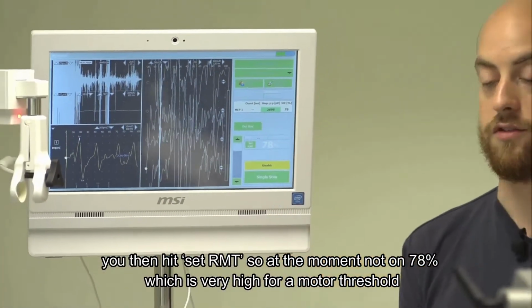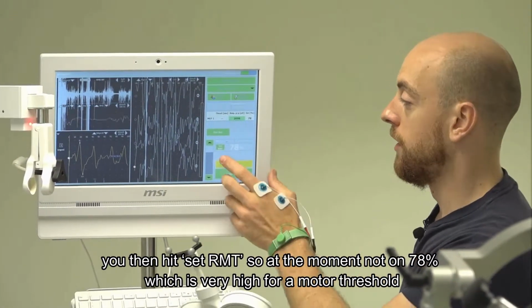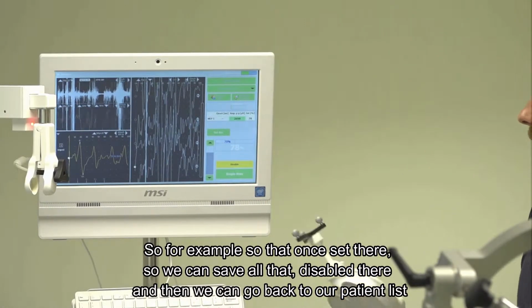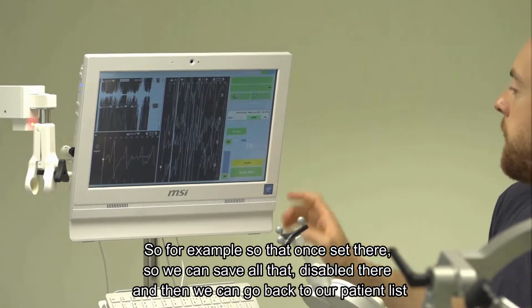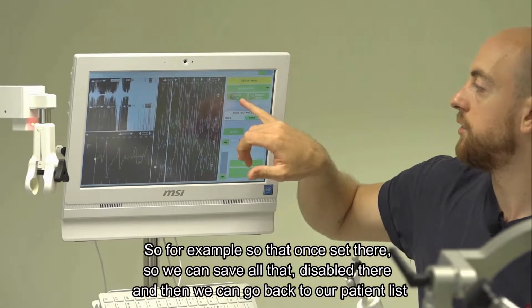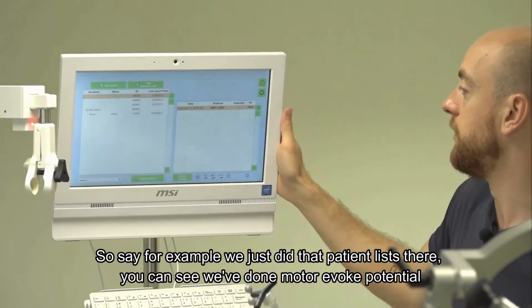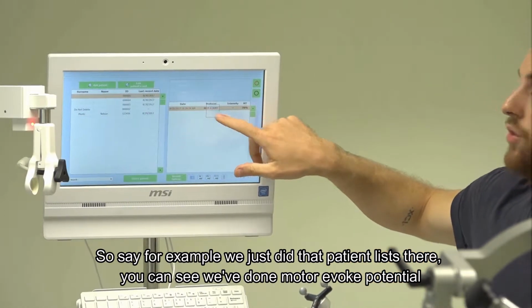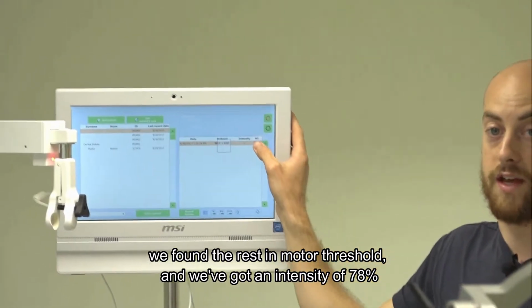At the moment, that's on 78%, which is very high for a resting motor threshold. But you set RMT there. So that one's set there. We can save all that, disable there, and then go back to our patient list. Say for example, we just did that. You can see we've done motor evoked potential, we've found the resting motor threshold, and we've got an intensity of 78%.